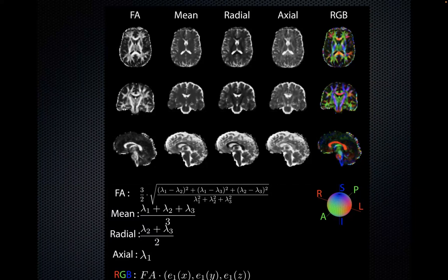And suddenly, in the late 90s, people started building atlases with these maps. And whole books like Gray's Anatomy labeling, okay, this is the cortical spinal tract, this is corpus callosum, this is arcuate fasciculus, this is the memory tract, this is the vision tract, without tractography, just with images.